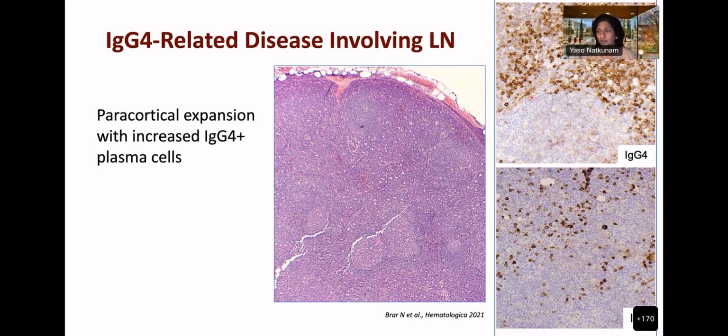So you need to be careful how you evaluate that. The standard criteria are 40 and then 100 as a high power count, but be careful how you apply them. And it's also always good to have the serology confirmation. So, communicating with your clinician.